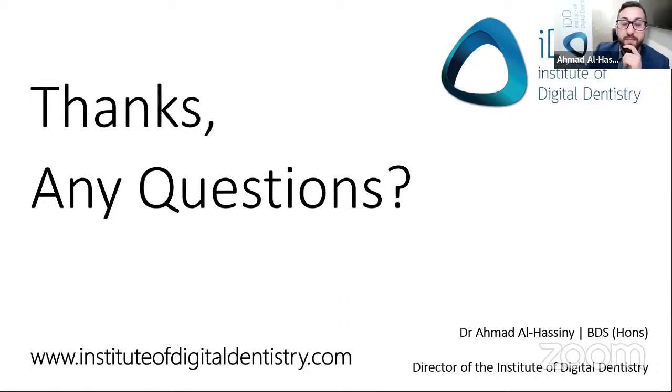Scanning tips, yeah, to be honest, the exact sterilization instructions, thanks George for the question, thanks everyone actually, are basically found on Medit's website. I don't have the exact details. Unfortunately, there are some things I do delegate and leave to my staff. One little tip is make sure you get a piece of square gauze and put it in the mirror area where the scanning tip is. Pack it in there, not too tightly, and it will prevent you getting water spots.